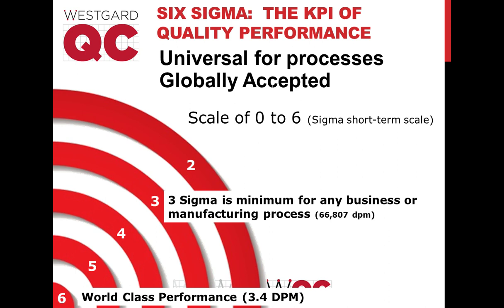That's an interesting question. Typically, when we talk about how we obtain CV and bias, we obtain that through two different sources. So we would be running some kind of controls to determine our imprecision, and then we have some kind of external quality assessment or proficiency testing that may help us determine our bias.